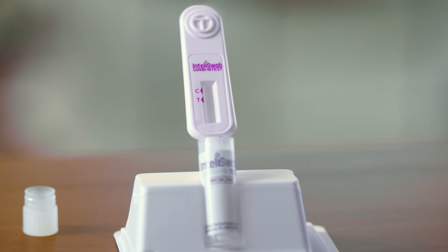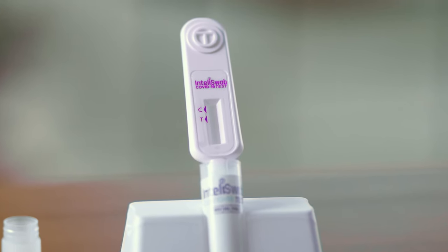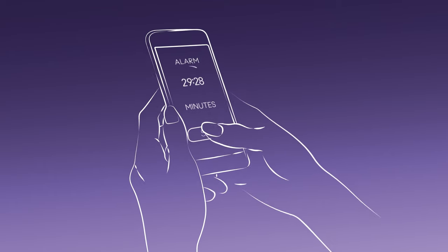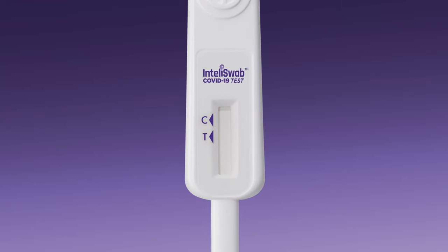Now, just leave the device in the tube with the results window facing you and the stick fully down in the tube. Start your timer for 30 minutes and do not touch the device or tube during this time. When you see a pink background pass through the results window, you'll know it's working.